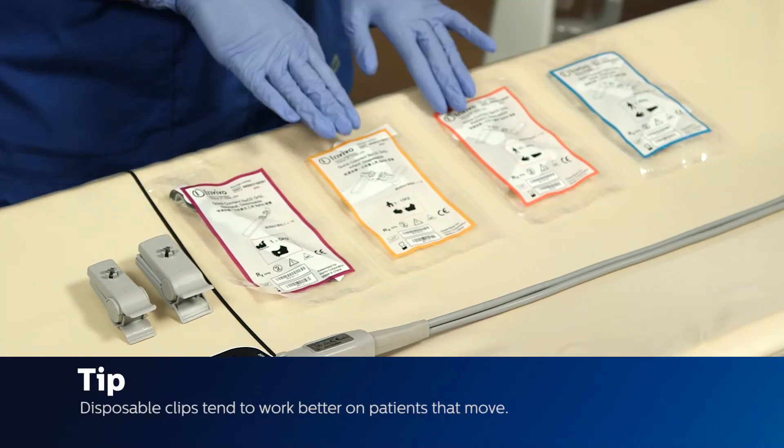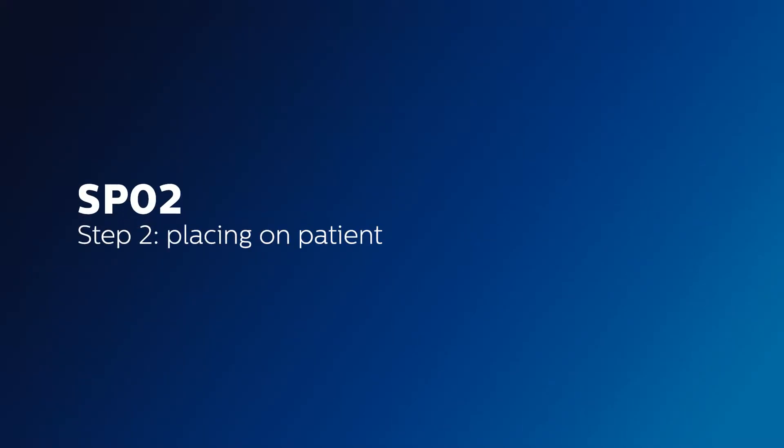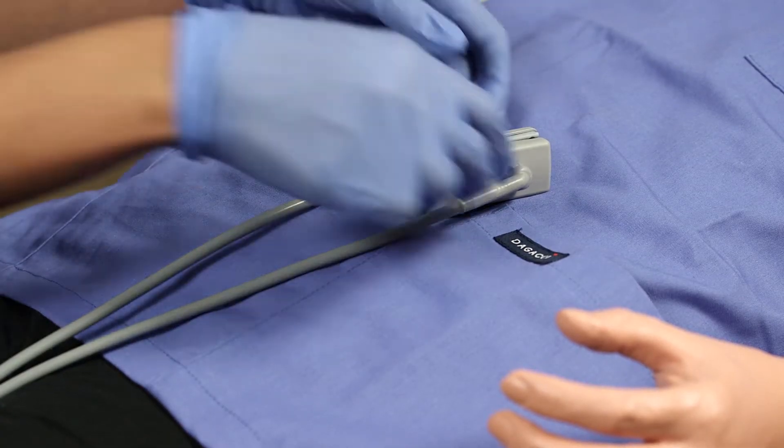Disposable clips tend to work better on patients that tend to move — they are very secure. After you have selected which clip is best for your patient, attach it to the SpO2 probe.